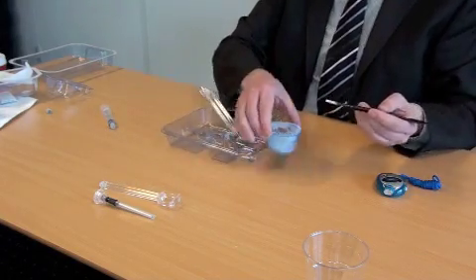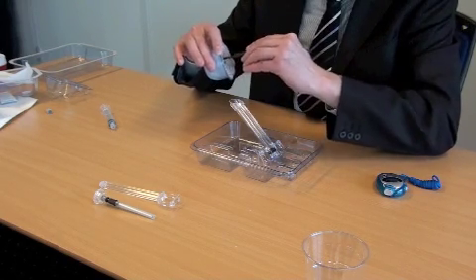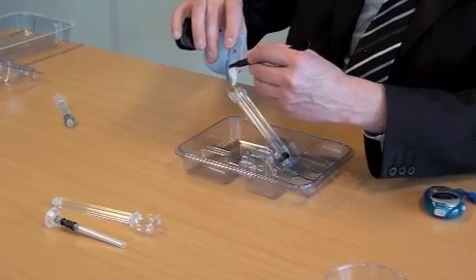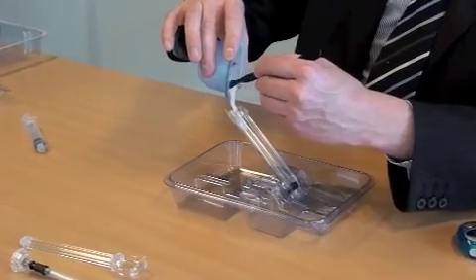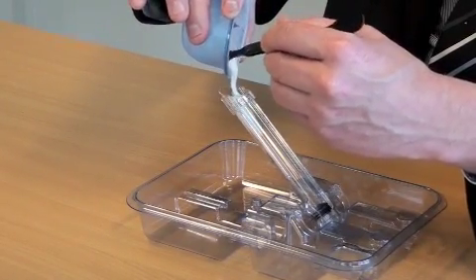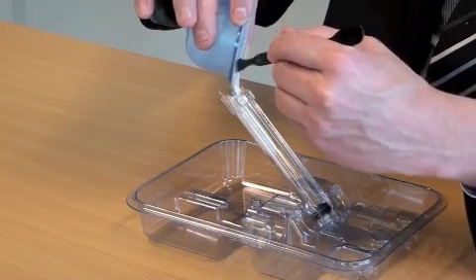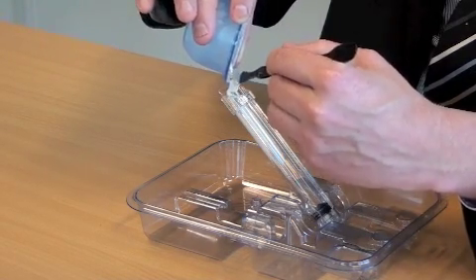It's time to load the syringe. So what do we do? You just scrape it all together, so one mass, and then it becomes one mass which you can pour into the syringe. And then we have to make sure that it gently slides into the syringe, and make sure the opening is not blocked by the Hydroset. So just keep an open air pathway. Here you can see very nicely how it is sliding gently into the syringe, very gently.